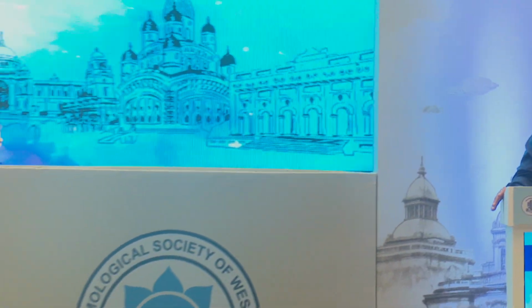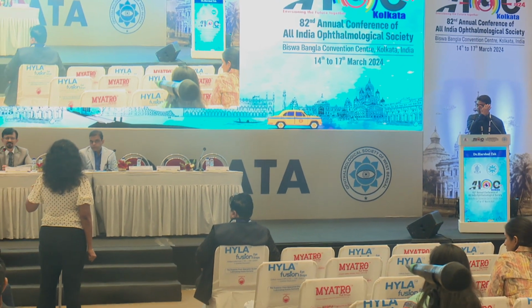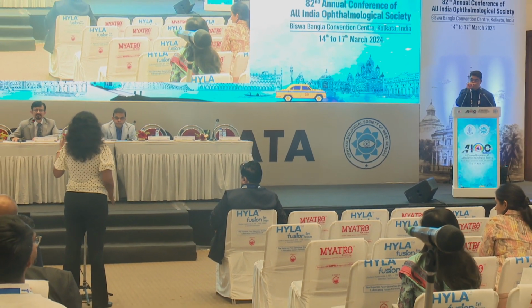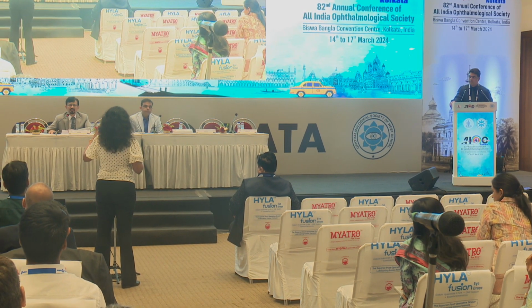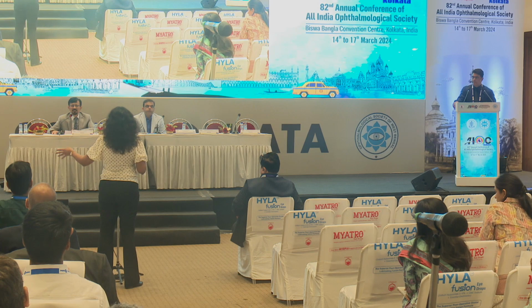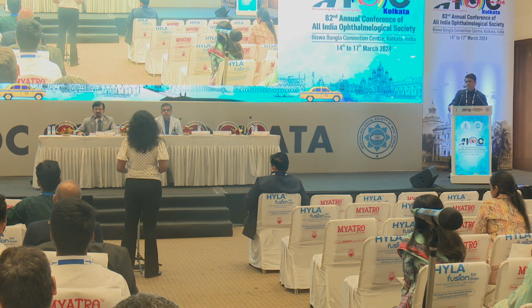Yeah, yeah. Thank you. Yes, Vanashri. So I have a doubt for all the panelists. If we have both the platforms available, I have a microkeratome as well as a femtosecond laser, and if the cornea is steep, at what level should we take a cutoff? Like, if it is beyond 45 or 46, should we prefer femto instead of microkeratome? What should be the cutoff for a surgeon to think about?